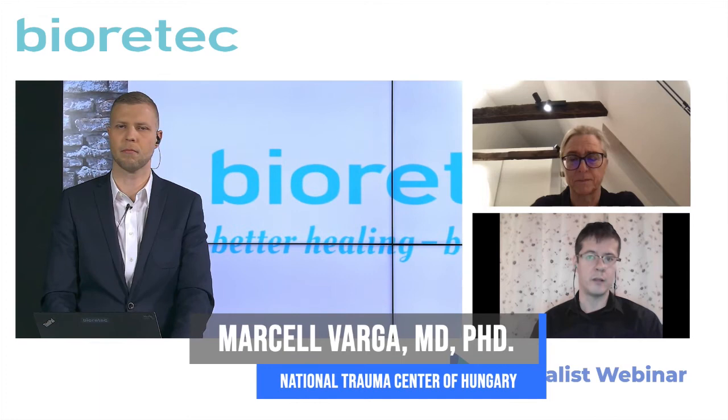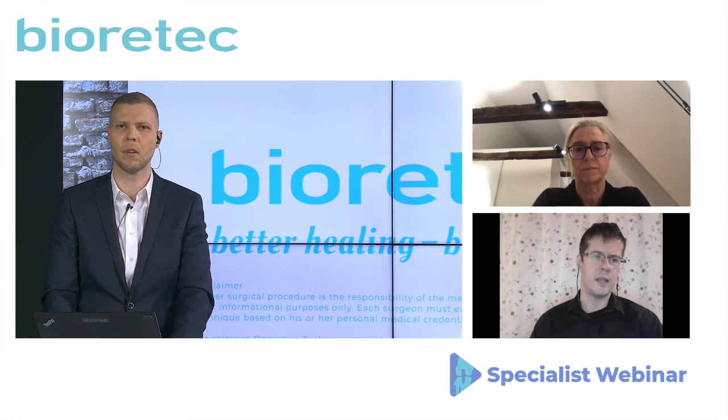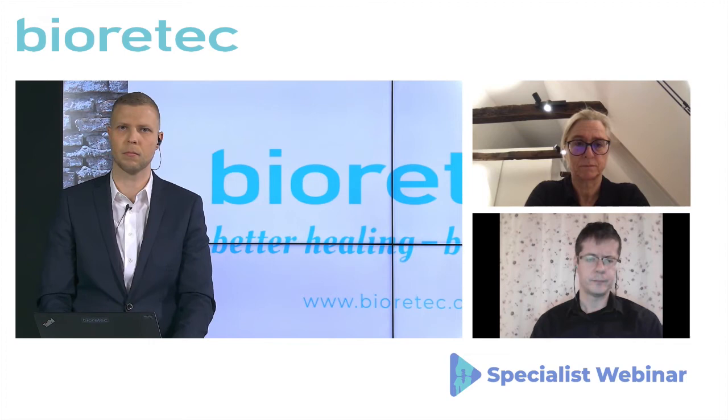Dr. Varga, is it possible to bend the dilator? Yes, definitely. As I say, sometimes you have to bend the dilators, like in a conventional ESIN technique. When I use ESIN, I bend the end of the nail. For the reduction, for maneuvering with the nail, you can bend it. The dilator is very similar to an ESIN nail, almost no difference. Okay. It is a little more rigid.